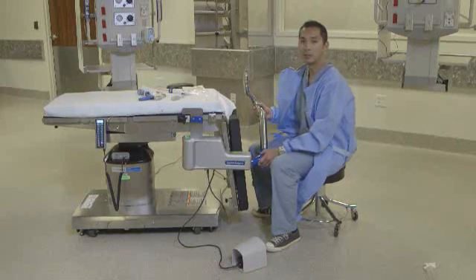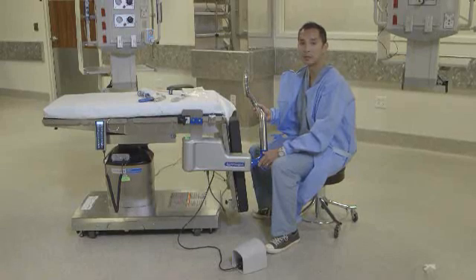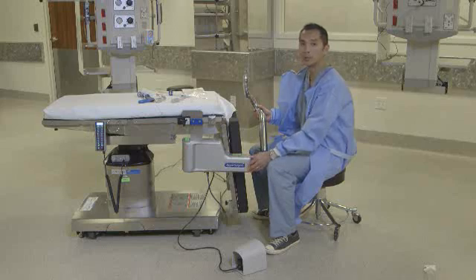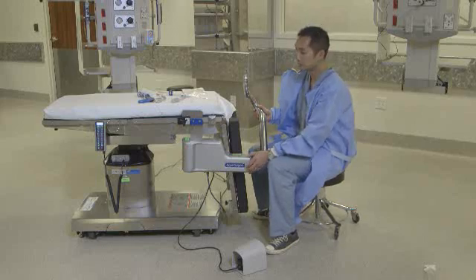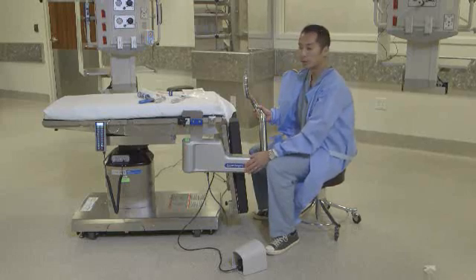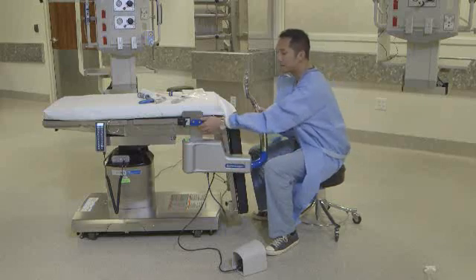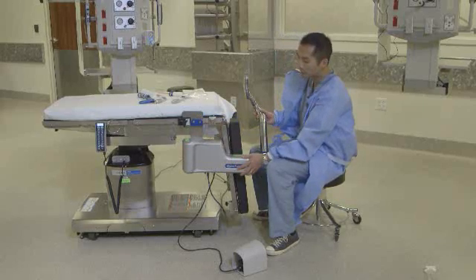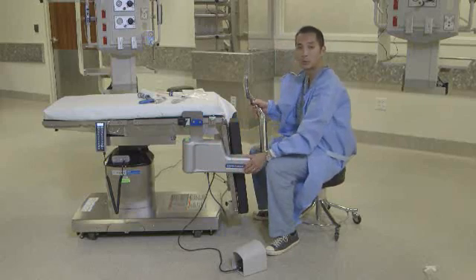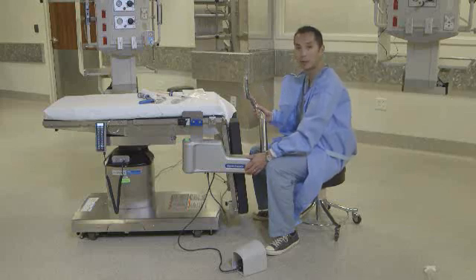Hi there. My name is Arne Advincula and I'm the Vice Chair and Chief of Gynecology at Columbia University Medical Center. Today I'm here to talk to you about the new Ally Uterine Positioning System, otherwise known as the Ally UPS. Some of you may have been historically familiar with the original uterine positioning system, but with some ingenuity and modifications, we now have a much more advanced system tailored to work with laparoscopic as well as robotic cases.